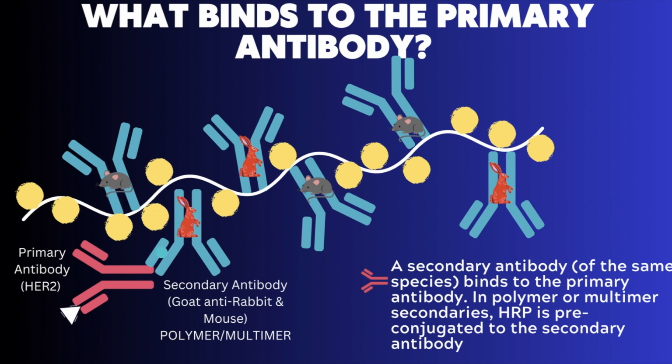These days, not all, but most clinical kits are a cocktail of mouse and rabbit secondaries. That's because most human reactive antibodies are manufactured inside of mice and rabbits. There's a whole other world of antibodies grown in goat, donkeys, sheep, horse, and more. But for now, we will focus on the common secondaries that are used on human tissues.